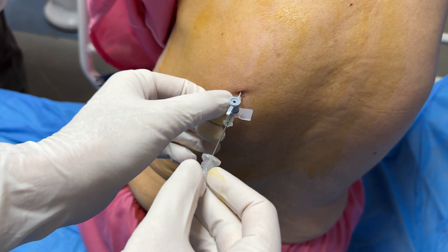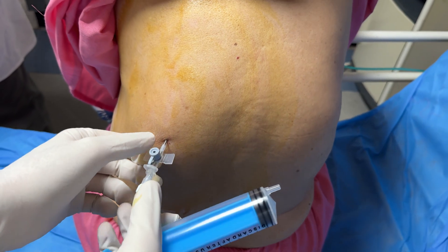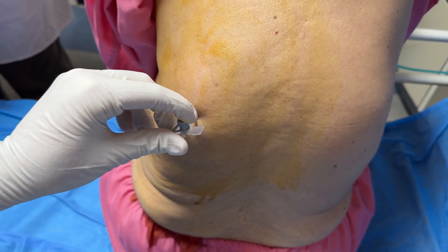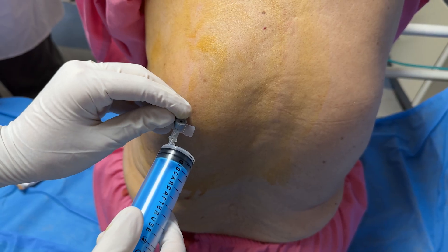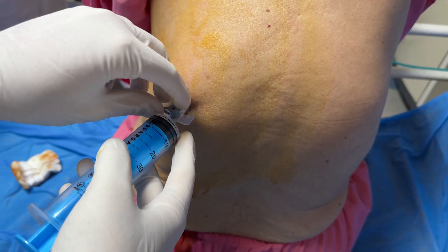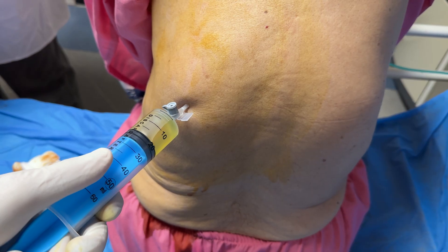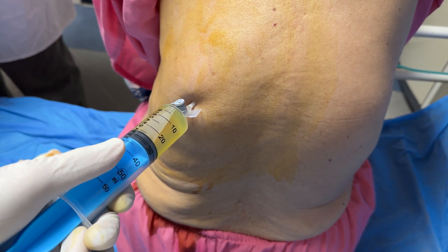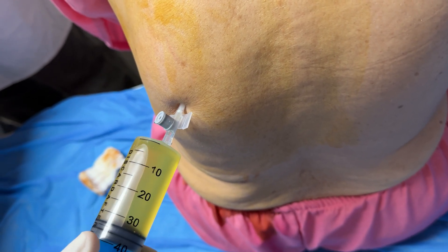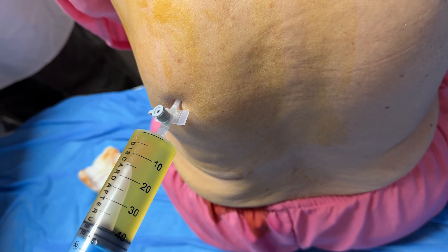The fluid begins to drain — typically straw-colored in liver disease, sometimes more serous in heart failure. We attach the syringe for the first aspiration. What are we looking for? Is the fluid bloody? If so, does it clot? If it clots, it's likely a traumatic tap, and we may need to reassess. In this case, we are expecting a transudate due to her heart failure, but with her cancer, we must also rule out a malignant exudate.